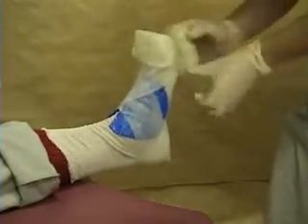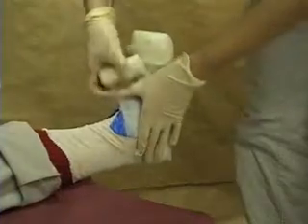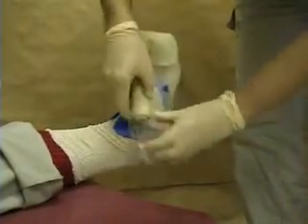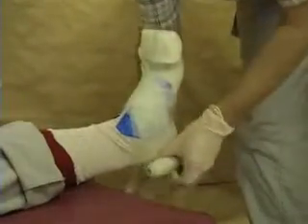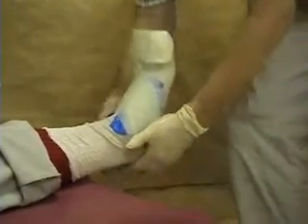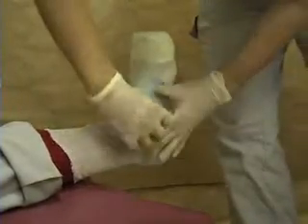Now our aim here in wrapping this material is to provide complete coverage of the foot, but more particularly to provide thickness and therefore strength in the parts of the boot that are going to require it. So that's down the sides here in particular, and underneath. Instructions for this material say that you should stretch it as you're wrapping, stretch it by about 10% of its length. Just trying to make sure that we cover the whole of the foot, coming to the end of the first roll here. So we're going to use a second roll.